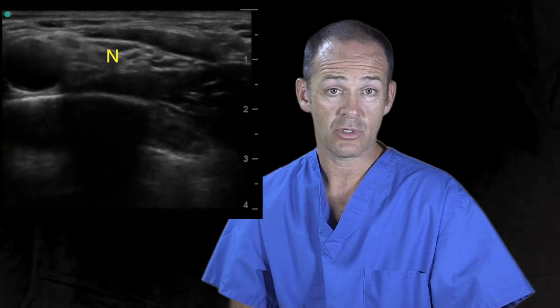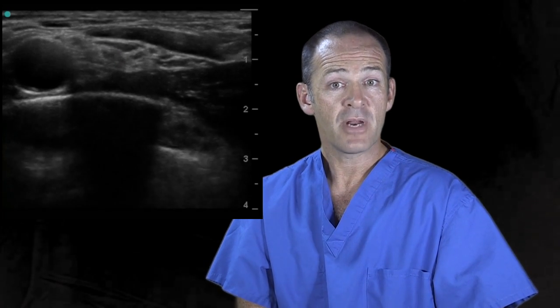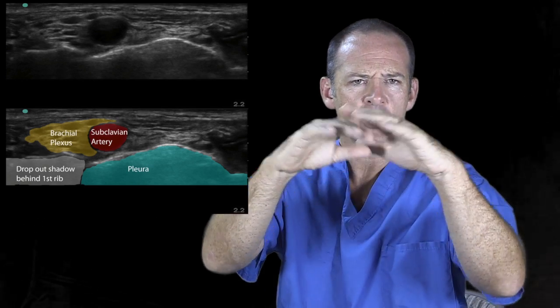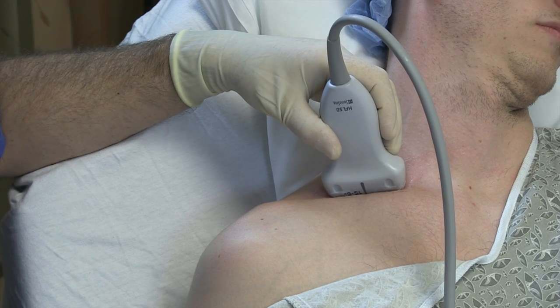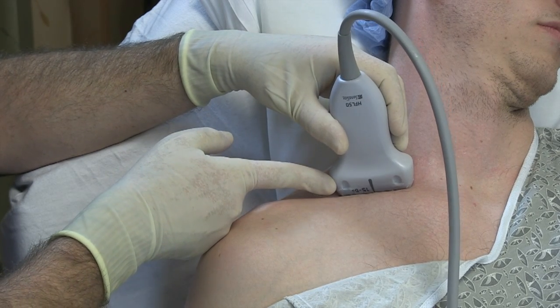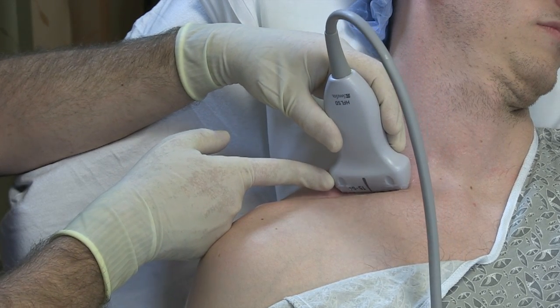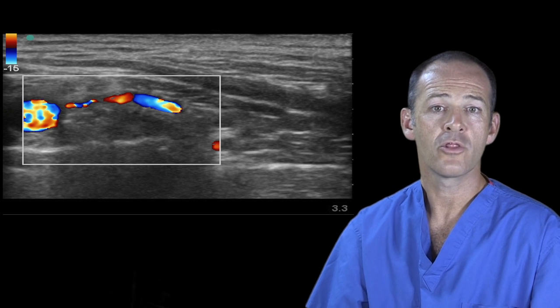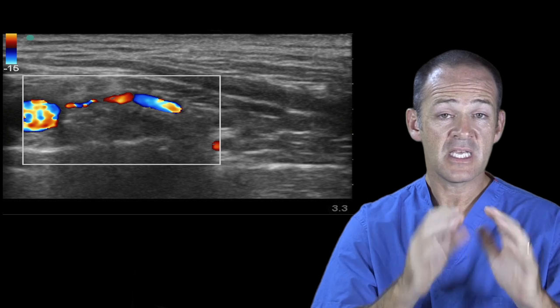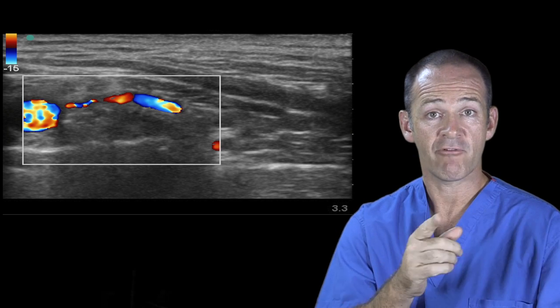If the artery is not initially visible, slide the probe parallel to the clavicle, medially or laterally. Take caution not to mistake the carotid artery for the subclavian — you could be too medial and scanning the carotid by mistake. The nerves are located posterior or lateral to the artery, occasionally superior. The brachial plexus appears as a bunch of grapes — hypoechoic dots enclosed in a hyperechoic fascia around those dark circles of the nerves. If the image doesn't appear crisp, consider rotating the lateral part of the probe away from the clavicle to image the nerves more in cross section. Prior to needle insertion, turn on colour Doppler to look for blood vessels that may course through or around the brachial plexus, as these can block your path to the nerves.